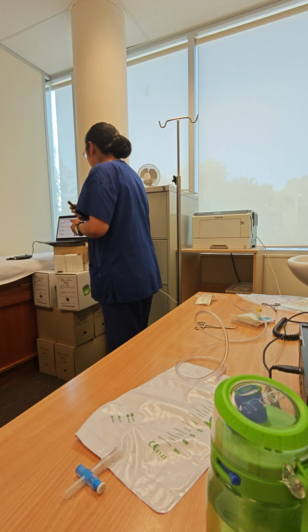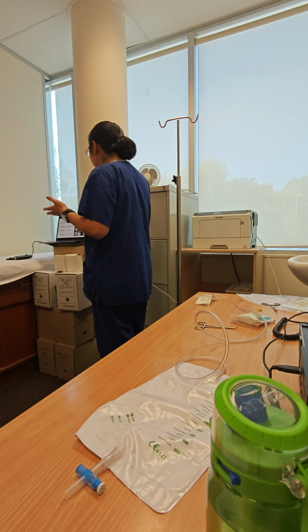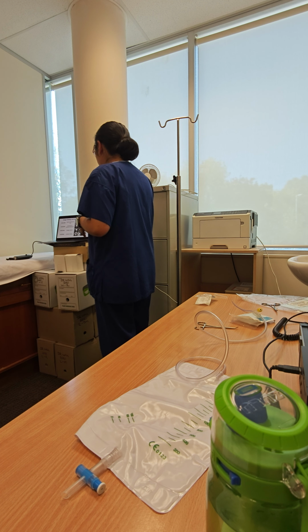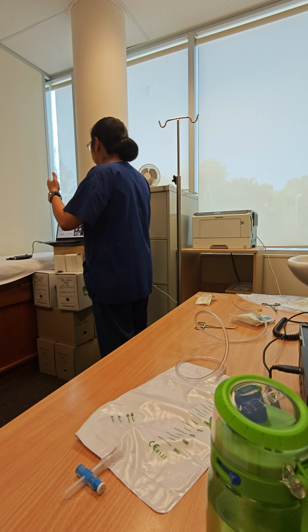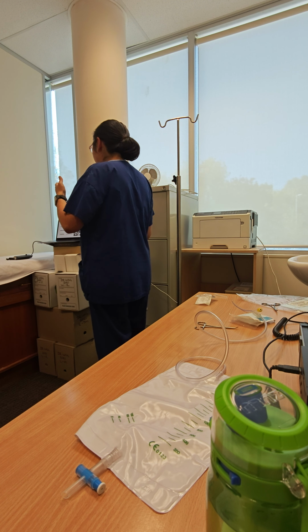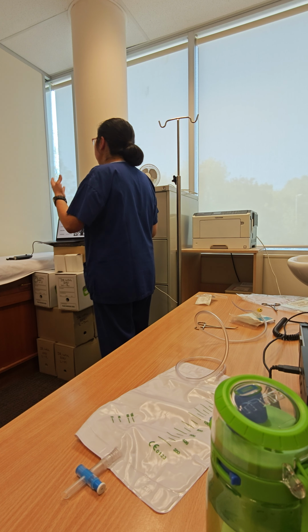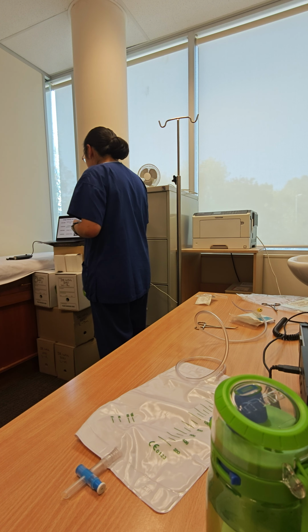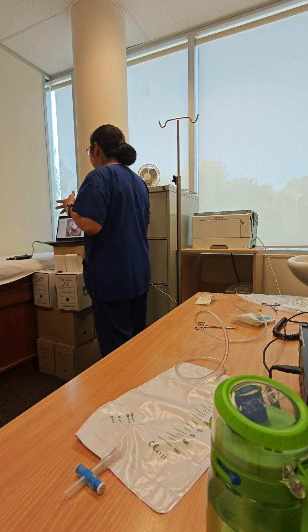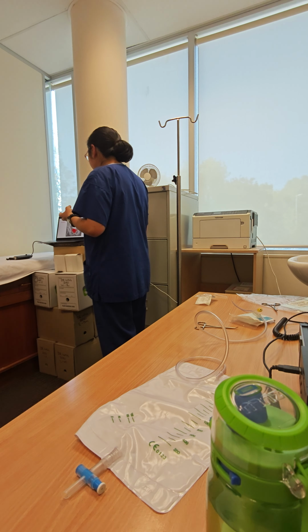All right, let's have a look at what we found in all the images. These images, from the left to the right, are the supine bladder, left oblique, and right oblique bladder. It's too small to have a look, so let's zoom in to see what happened exactly. That's the first time, on the 25th of January.